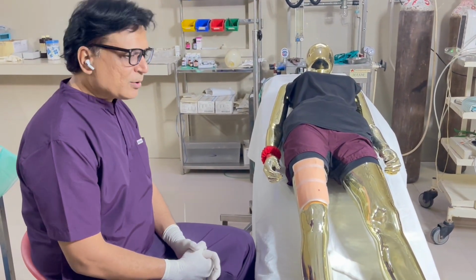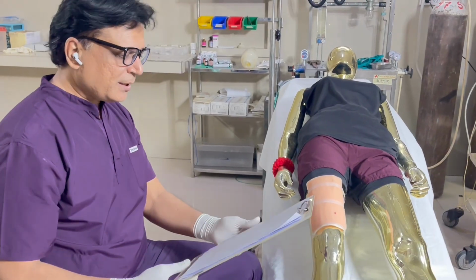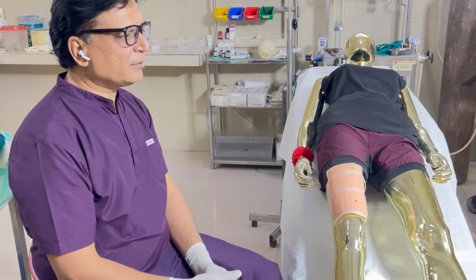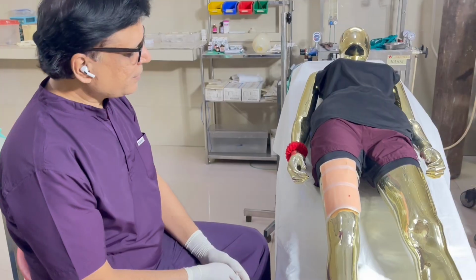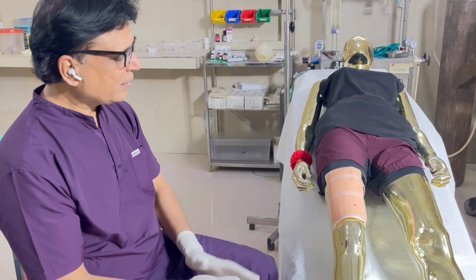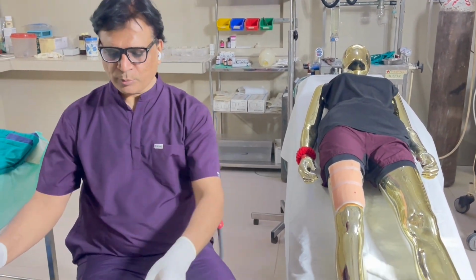Yeah. Okay. Have you signed the consent form? Let me check this. Okay, Smith, so it's your signature. I have got a WHO checklist. You are having the mole on the right thigh; the wristband, the name, the age, it's matching. So I will just be preparing my instruments.